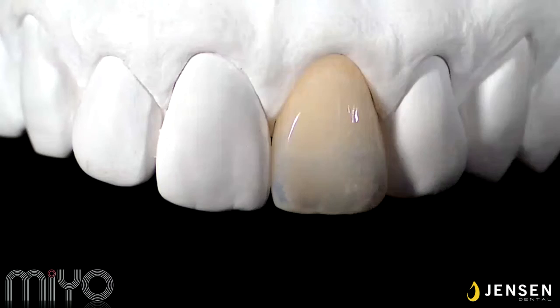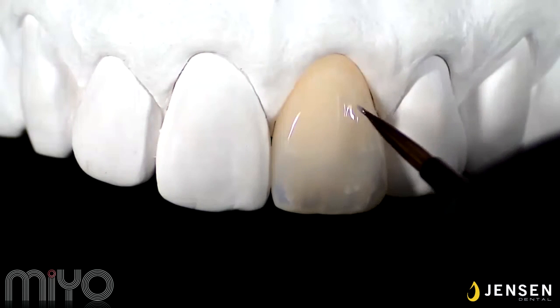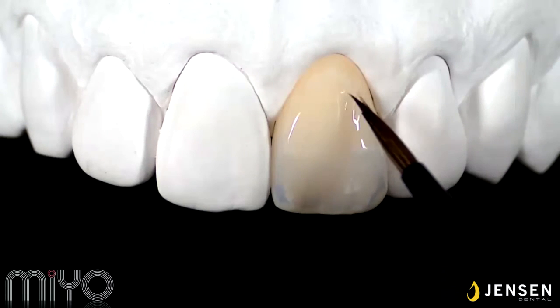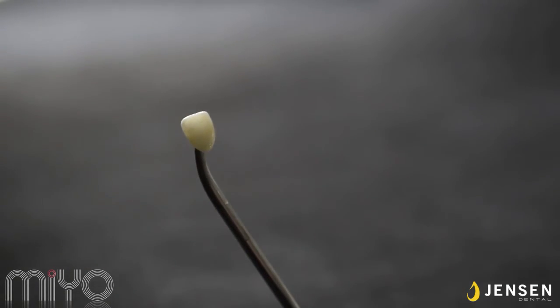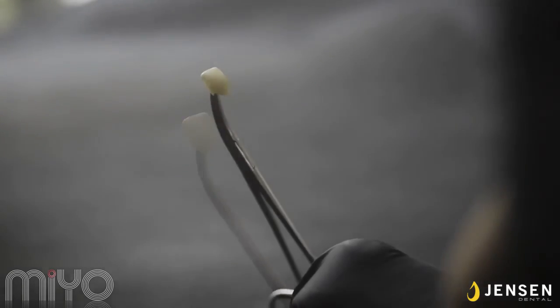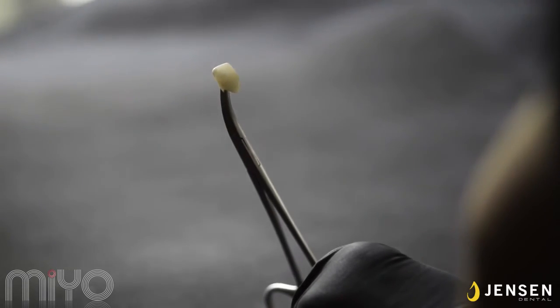The reason for spray glaze in the one-shot technique is to avoid altering the position of all the colors and effects that are applied and have the glaze coating on top. Key to spray glaze is not to hit the restoration on your initial spray. Spray to the side and drag it across the restoration 2 to 4 times before firing. And here's the fired look.